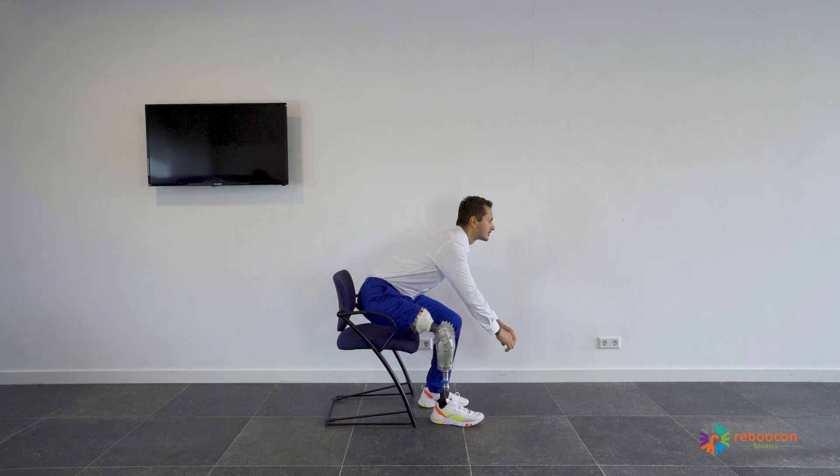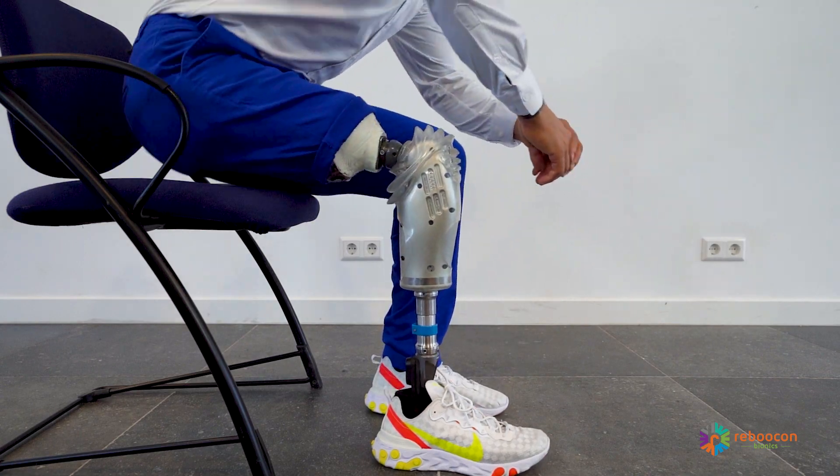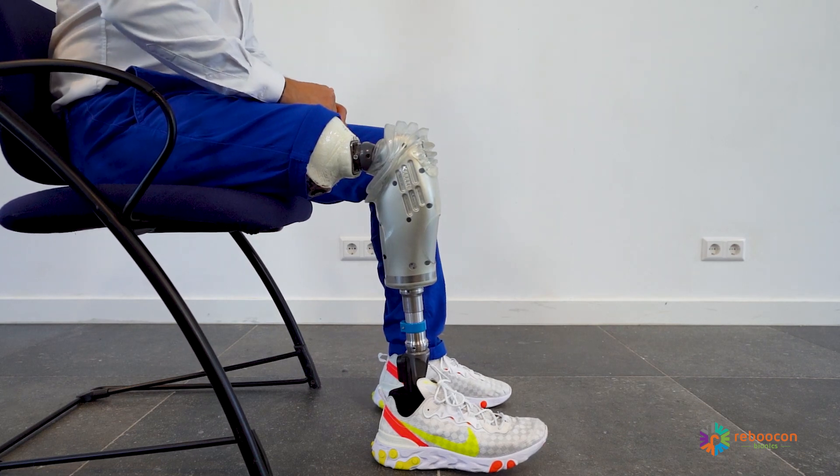To sit down: load the prosthesis, distribute the weight evenly, and shift the weight towards the heel. Sit down in one fluid motion.